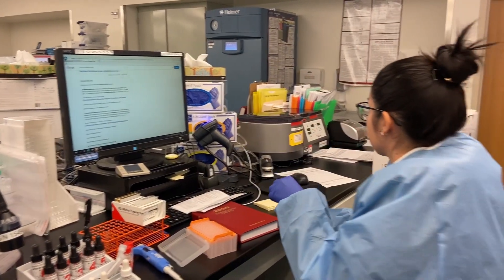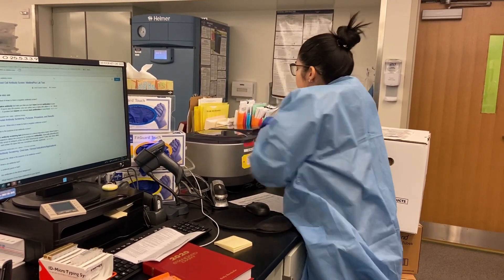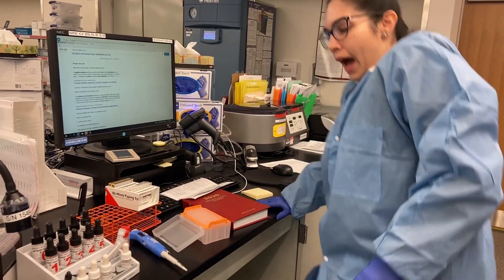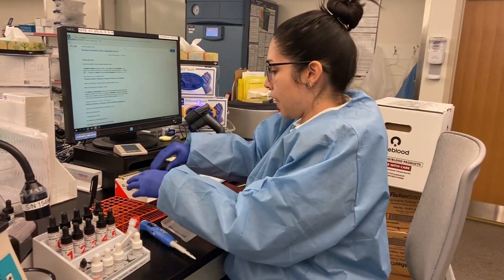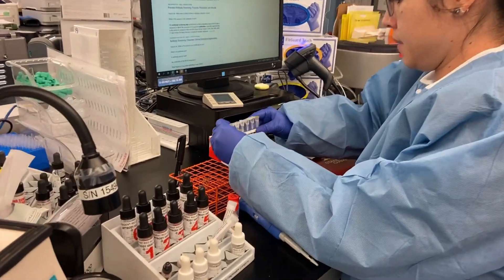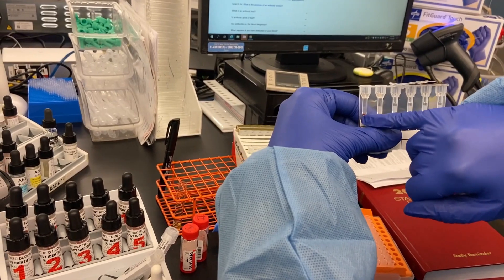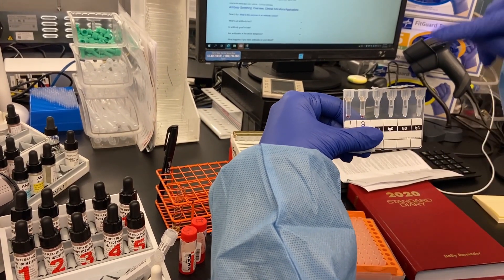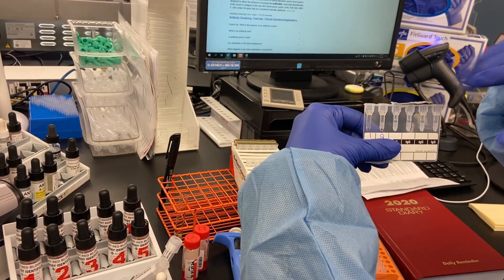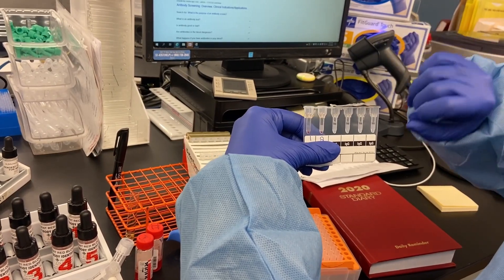Then I'm going to put it to incubate at 37 degrees Celsius, spin it for 10 minutes. If there's a reaction — I don't have any reaction here, but covering up patient info — this result is negative, so the red blood cells are at the bottom. If it was positive, they would be at the top or dispersed throughout. Gel is usually a lot more sensitive than tube.